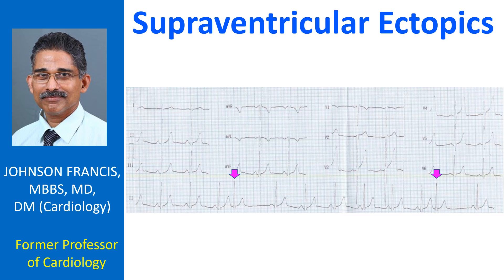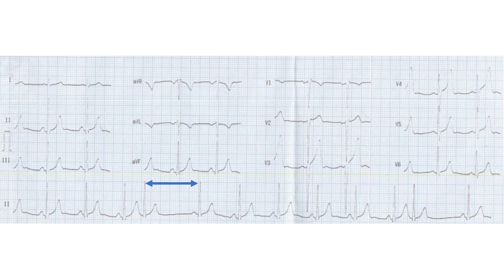Supraventricular ectopic beats originating in the atrium or upper part of the AV junction have P waves preceding the QRS complexes, but these may be submerged in the T wave of the preceding beat. Mid-junctional beats have their P waves within the QRS complex and hence obscure. In a low junctional rhythm, inverted P waves can be seen after the QRS with a short RP interval. In the current tracing, no definite P waves belonging to the ectopic beat are discernible.